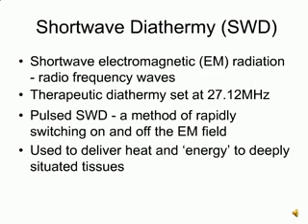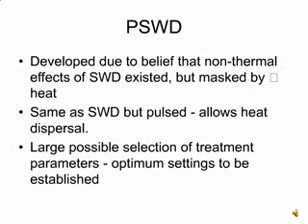Shortwave diathermy is used to deliver energy to deep tissues and may cause significant heating effects, with all of the therapeutic effects that may bring. Pulsed shortwave diathermy was developed due to observations that some of the effects of shortwave diathermy could not be attributed simply to the effects of heating.